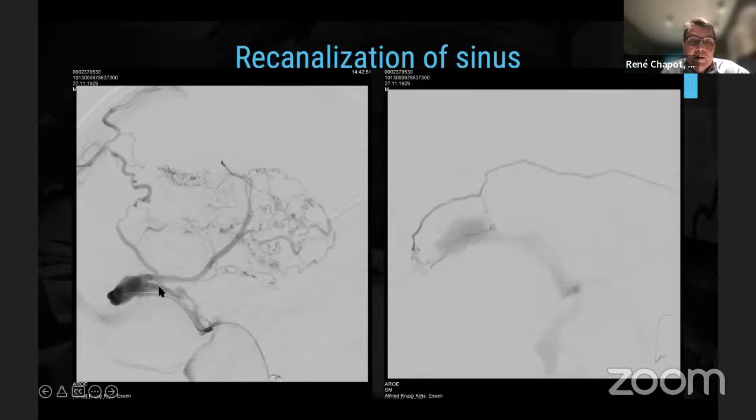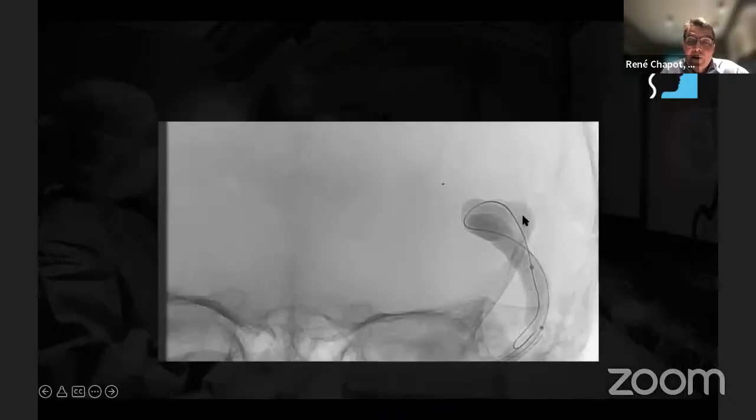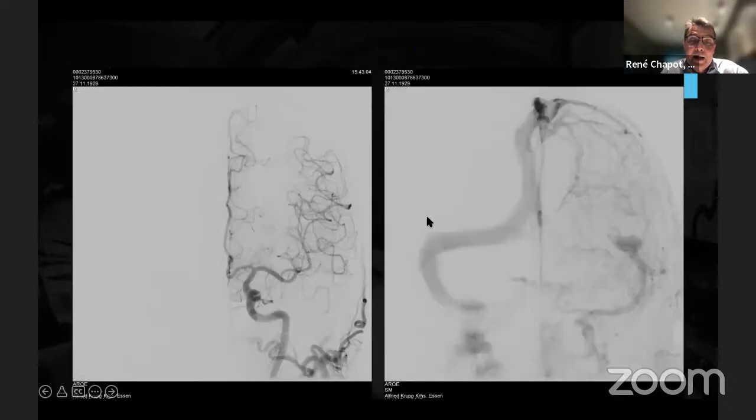This would cure, but why not restore, as we already recanalized? Which means we take the compliant balloon, make a kind of knot, and we can U-turn here, and then accessing through the arteries, we occlude the fistula. Since the sinus here was occluded, we have no risk in placing a stent there. I mean, if the stent re-occludes, then we go back to the previous situation.